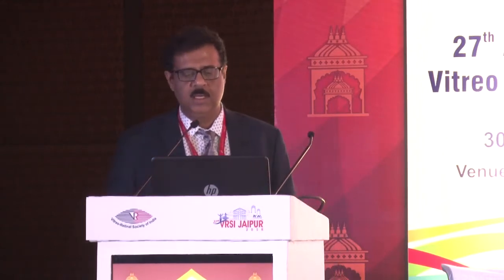Retained foreign body with endophthalmitis is always challenging. You have to search for the foreign body. This is another tricky situation. Remove all kinds of vitreous abscess. Here I have, okay. So I use the suction of the cutter here, and as I have done the lensectomy already, I removed the foreign body through the paralimbal route.